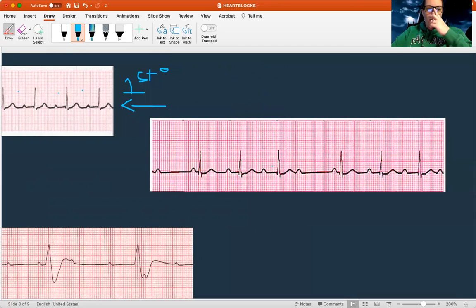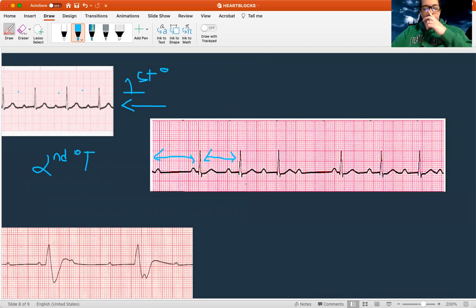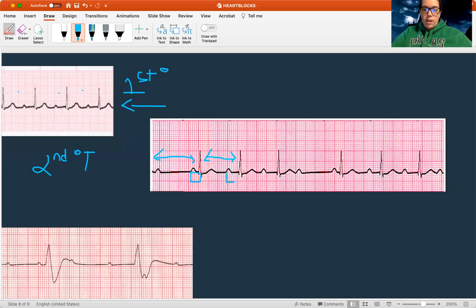Let's look at this next one. First — is it regular? I have a long distance here and a shorter one here, so there's some irregularity. If there's irregularity, this has to be some sort of second degree. Now I need to look at the PR interval. This one looks normal, this one's getting longer, this one's getting even longer, and then look — there's a dropped beat. Longer, longer, drop — that's a Wenckebach, second degree type one.